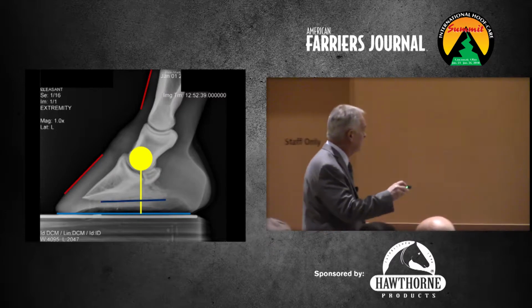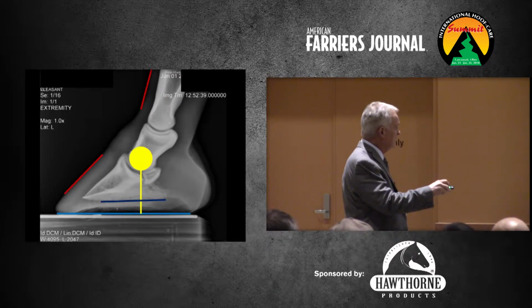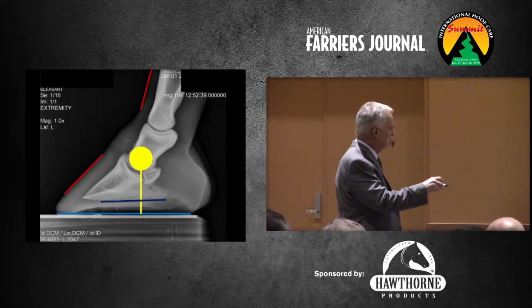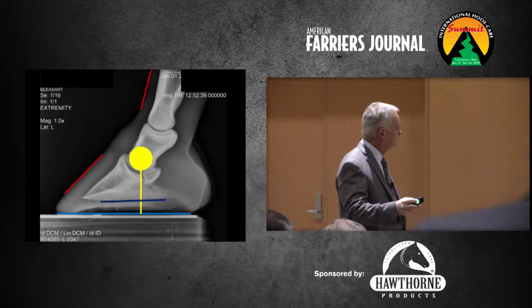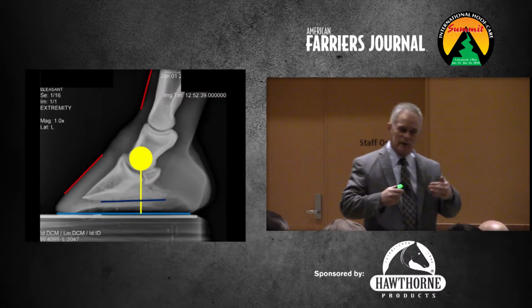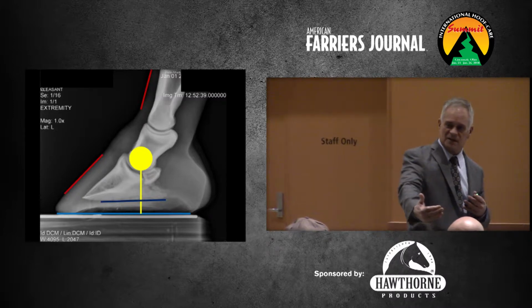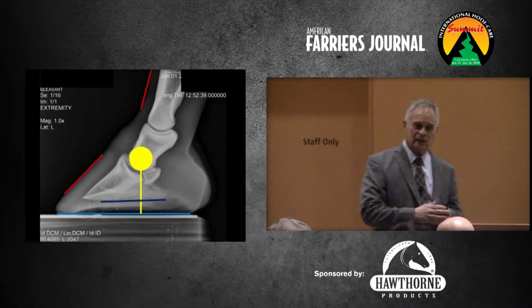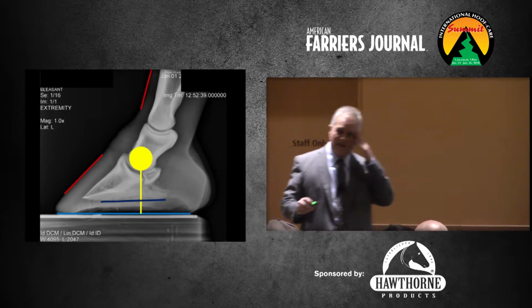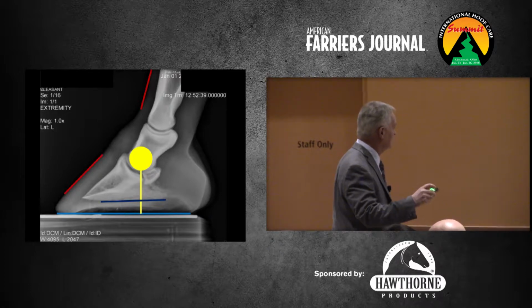So there they are. And that highlights that broken back hoof pastern conformation, flat palmar angle. How's his base of support? So he looks like we would call that, when he's got more foot in front of that center of rotation, a forward base of support. Okay, forward base of support. So those are the things you're kind of looking at while Dr. Pleasant and you are looking at these.